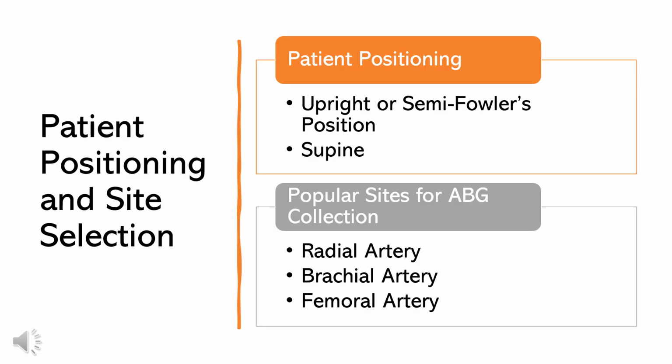Your role as a nurse in ABG collection is not hands on in terms of drawing the blood, but it's absolutely critical for patient preparation and assisting the healthcare provider. Proper positioning and site selection are key elements that significantly impact the accuracy of the ABG results.